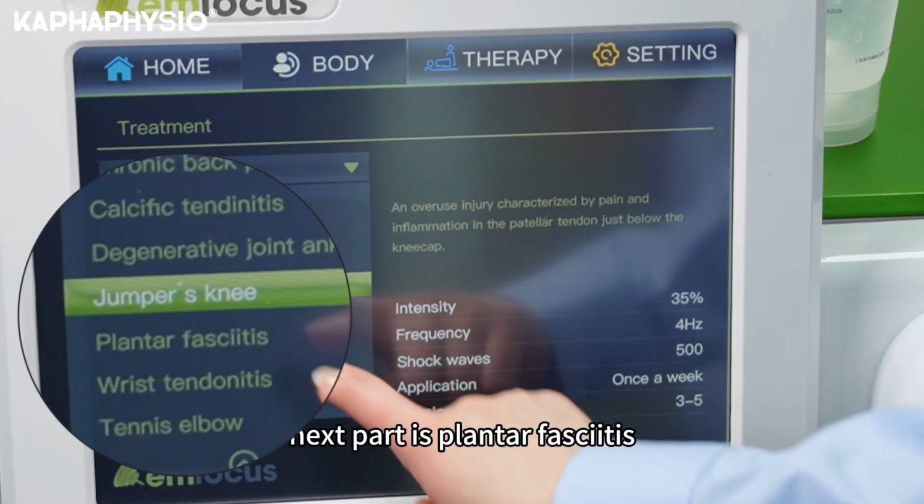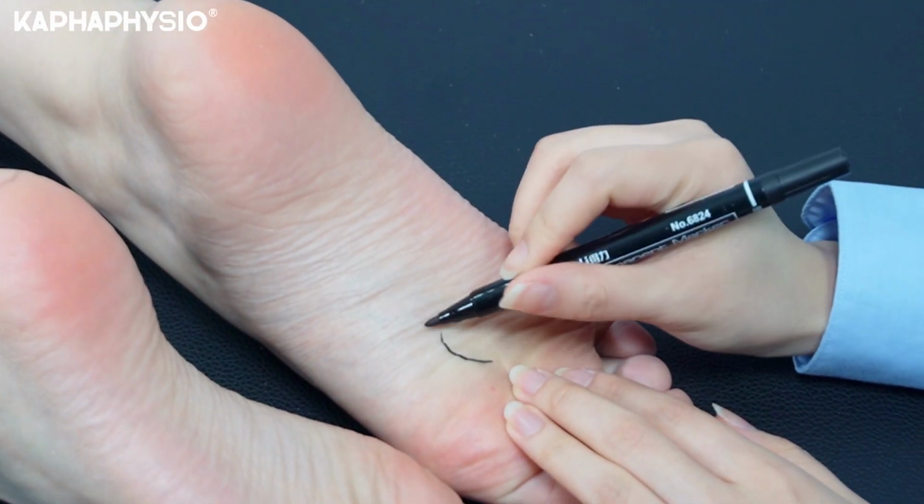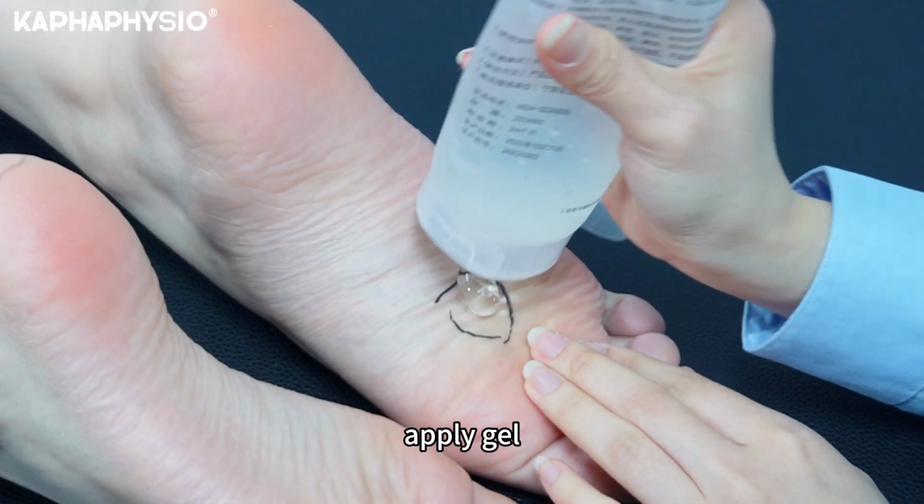The next part is plantar fasciitis. Find the trigger point. Apply gel.